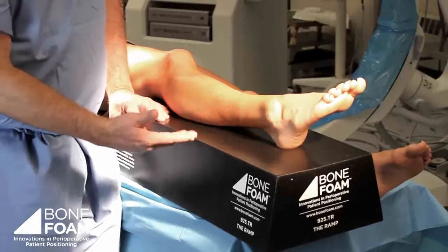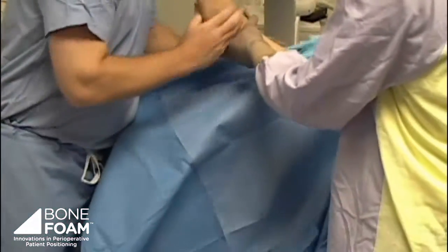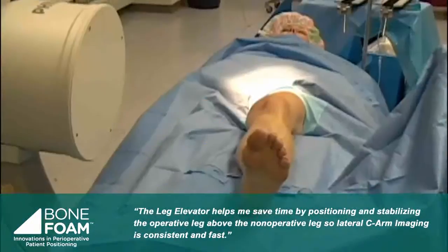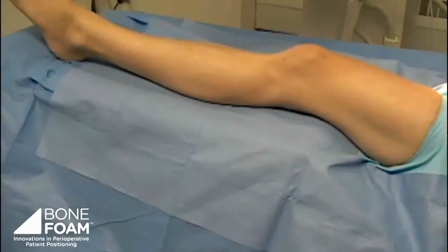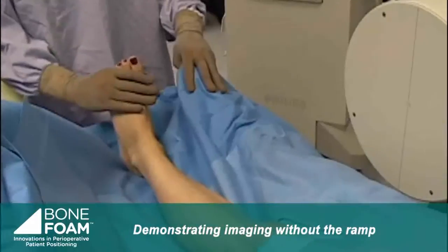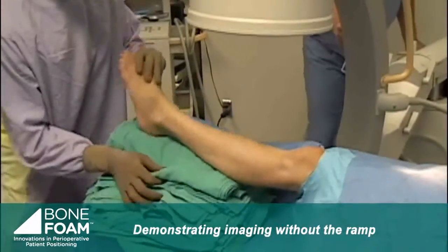And this is designed in a way to be able to go under the drapes or over the drapes in a custom bag. I'm going to demonstrate now, with putting a drape over it, that we're basically going to eliminate the other leg from the field. The operative leg is now elevated to allow clear lateral imaging. Without the ramp or stack of towels, the surgeon has to lift the leg, potentially malreducting provisional fixation.